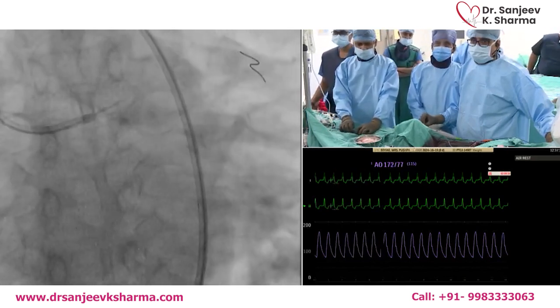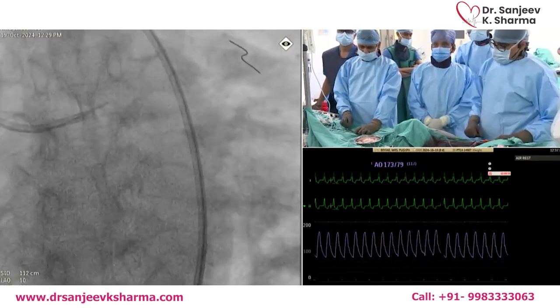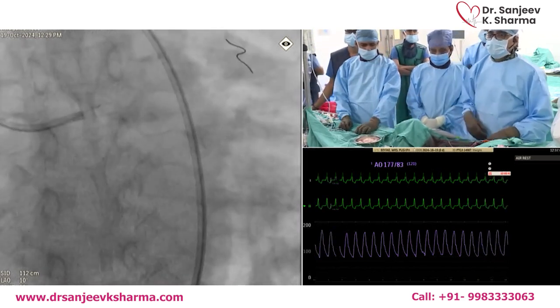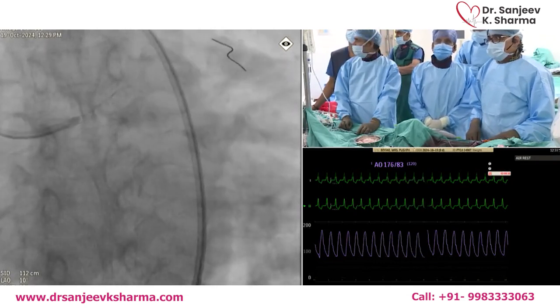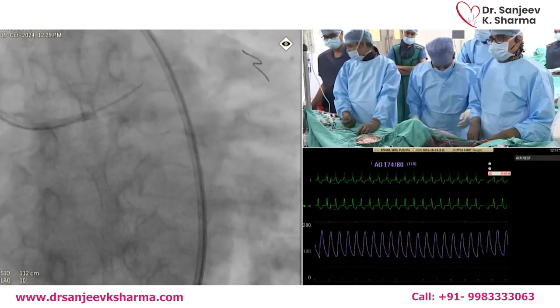Dr. Sharma, it's Roxana. This is a very, very interesting and very important use of imaging in choosing exactly what you're doing. But I guess one of the big questions is, if you were told you can't use orbital atherectomy, what would you be choosing? Would it be rota or shockwave or neither?